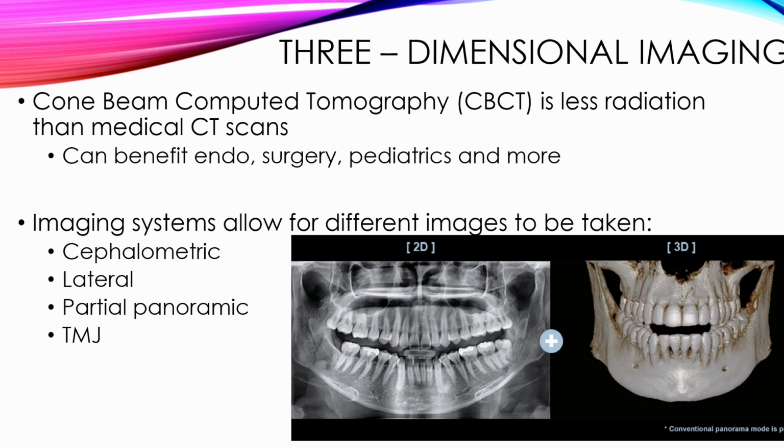And because it's in 3D, the patient can obviously understand what part of the mouth we're talking about. And so it just makes communicating that much easier. The cone beam is less radiation than a medical CT scan. I think it looks like a CT scan, like you would go and get a CT scan of your heart or some other part of your body. But it's actually less radiation than a medical CT scan. These scans are pretty quick and easy. They last only about 8 to 10 seconds.